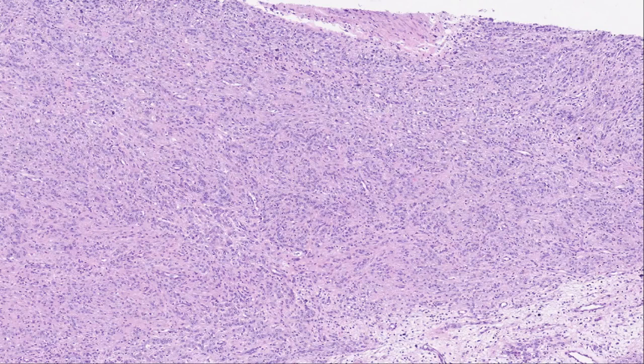One example of when immunohistochemistry is important is when we want to determine the type of cell in the tissue sample. Many cells can look alike and are not necessarily differentiable simply through analysis of structures they belong to. One such example is when we analyze tissues with different types of cells that have similar morphologies.